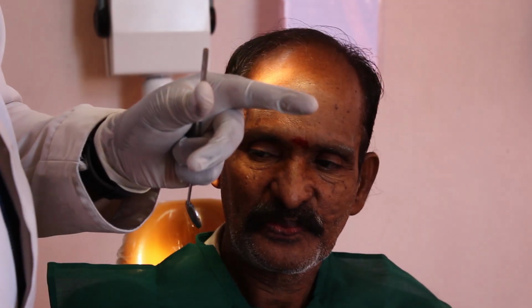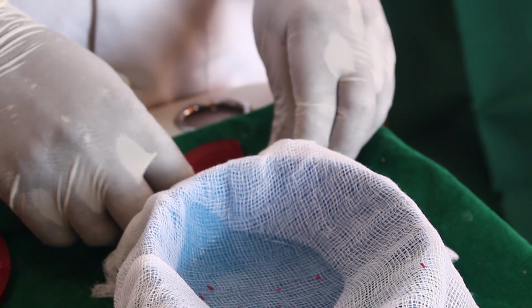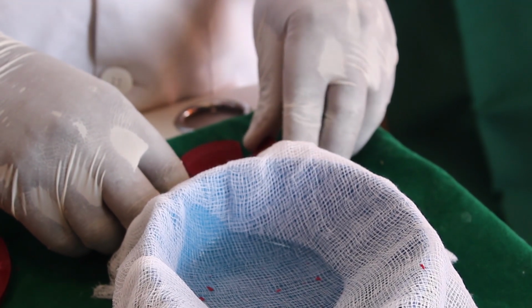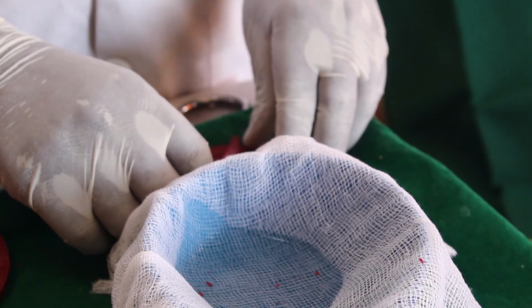So now we are going to see the impression making. Based on this patient's edentulous ridge and also soft tissue, I have chosen this impression compound for making the primary impression. In case there is an excessive undercut and also unsupported tissues, then you have to choose the irreversible hydrocolloid, that is alginate.